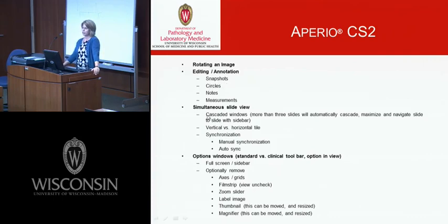You can annotate on there, and that's demonstrated with circles, notes, measurements, etc. It will allow you to open numerous windows. It will allow you to synchronize multiple slides together. And this is a very nice imaging, just a visual imaging tool.